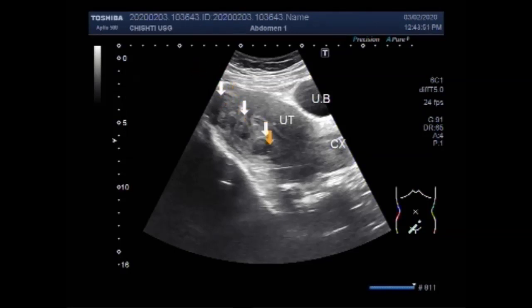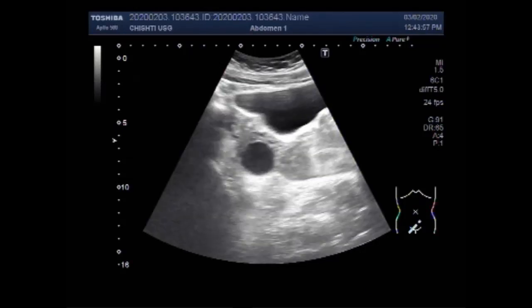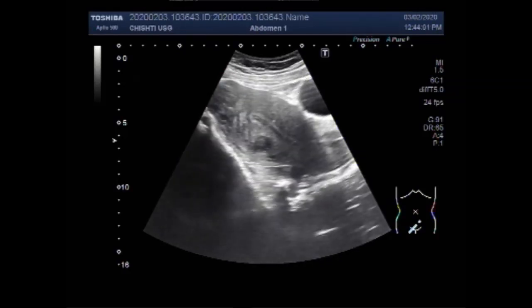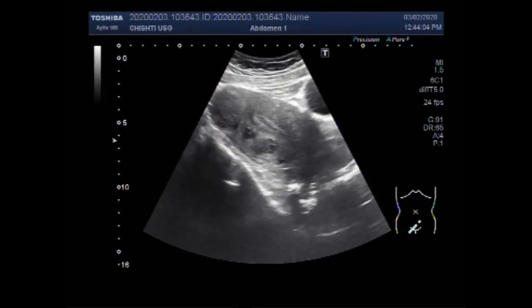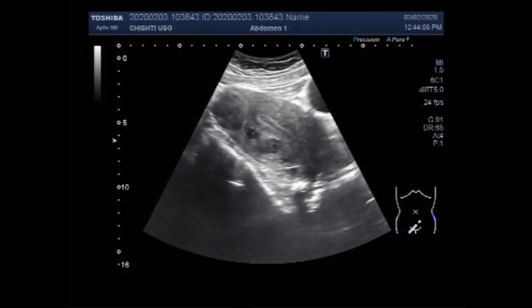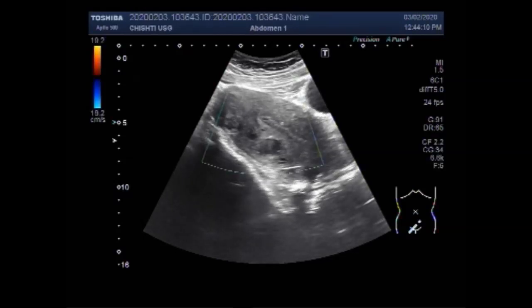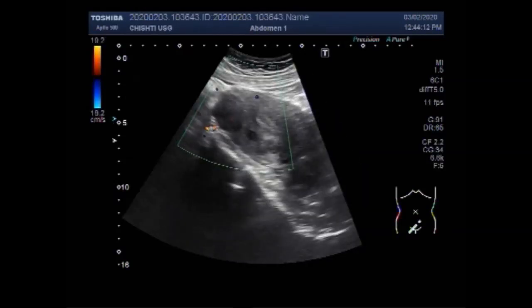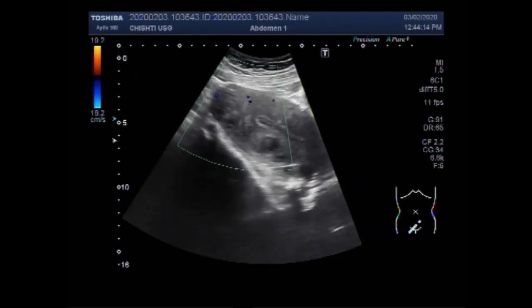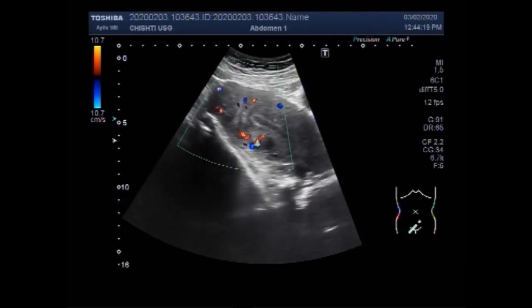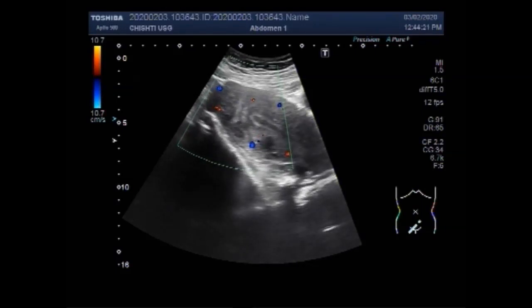This is another fibroid. These are the three fibroids seen in the uterus, in the middle and distal portion of the uterus. You can see these fibroids.